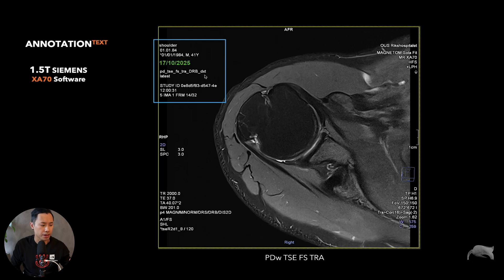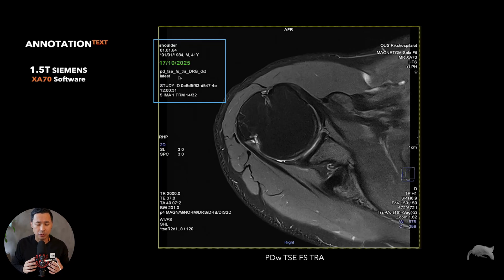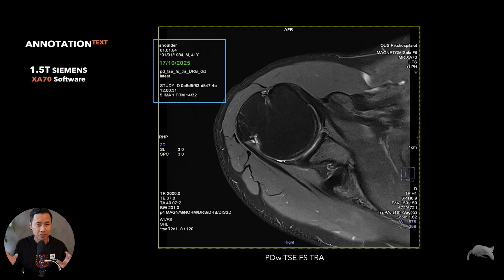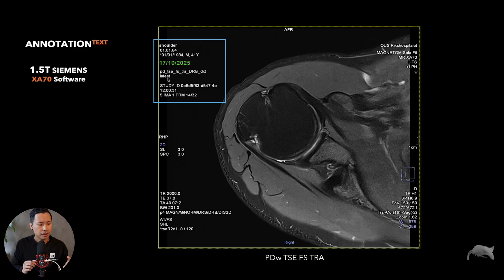In this setting DRB was used, and then right or left side - dexter means right side. If it's a T2 I would call it 'T2 turbo spin echo fat sat'. If you have a routine like that it would be easier for yourself and your colleagues to find different sequences - if you need T2 you know exactly, T1 you know exactly. 'Latest' means that if you do two or three sequences like this, it will name the most recent one as 'latest'.